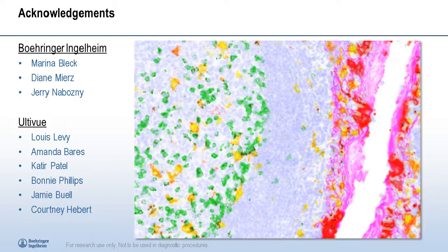We've also run some negative controls where, instead of using the barcoded antibodies, we use unbarcoded antibodies on the same pieces of tissue, or serial sections, and then we run the whole assay with an amplification reaction and with the barcode-specific fluors, and we pick up absolutely no signal. So I would suggest from that yes, they are absolutely specific to the amplified barcodes. But again, I can defer you to Ultivue for more details.